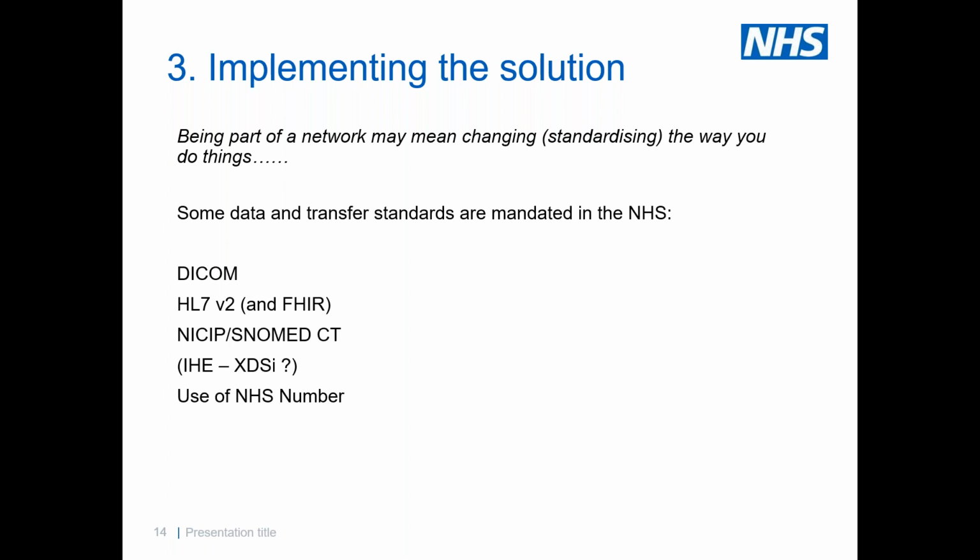DICOM, use of HL7 version 2, and eventually HL7 FHIR, although I suspect that's slightly further on. The use of the National Interim Clinical Imaging Procedures Code Set, or NICIP, and or SNOMED clinical terminology. These are all well understood and not particularly controversial standards.